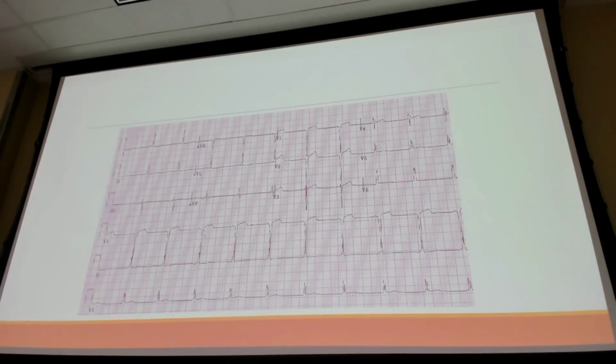What do we got on this one? You see anterior ST elevation, septal. This is like a septal MI. So you've got V1 and V2 certainly with elevation, questionable elevation in V3. Do you see any reciprocal changes? I don't really see any on there either.